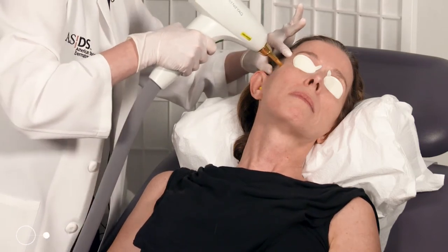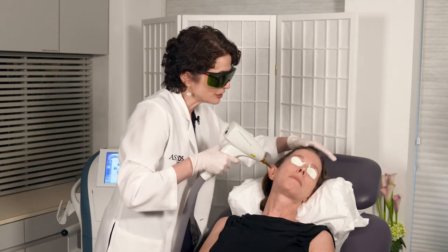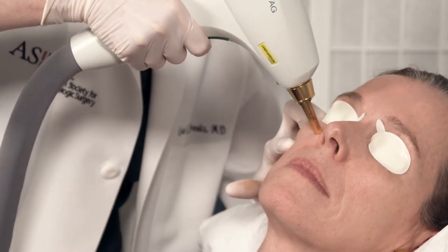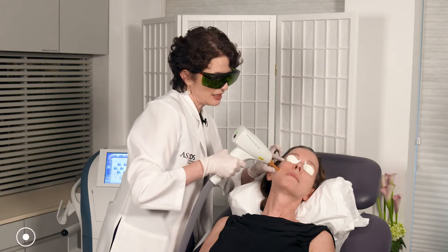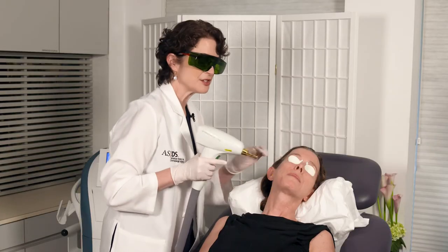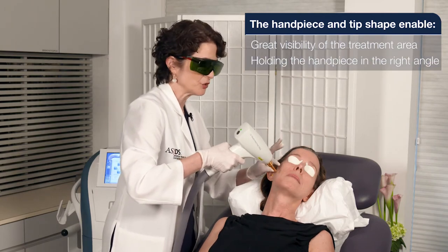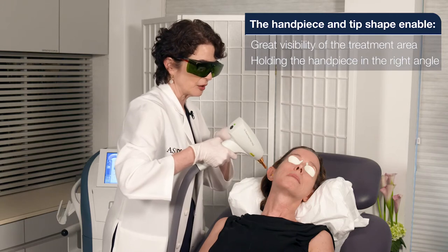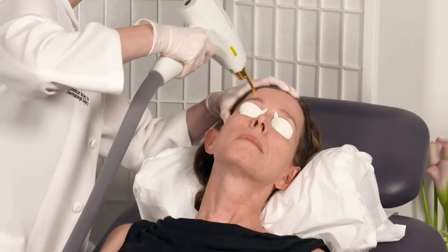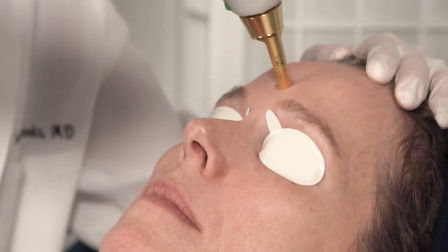It's very easy to maneuver and the treatment can be very fast. You may see a little bit of light around your eyes but you're still protected, so not to worry. I'm just doing two passes. This is very nice because it does not occlude my vision — I can see very well and hold the handpiece at a right angle, so I know I'm getting very good laser beam angle and penetration.